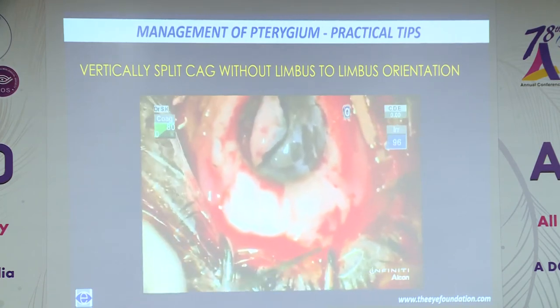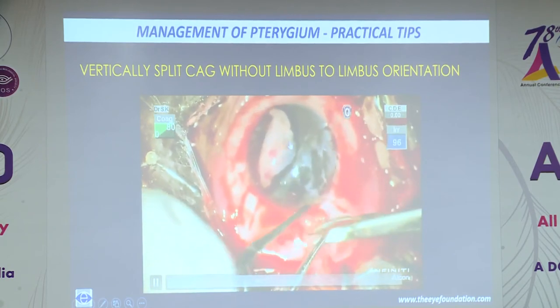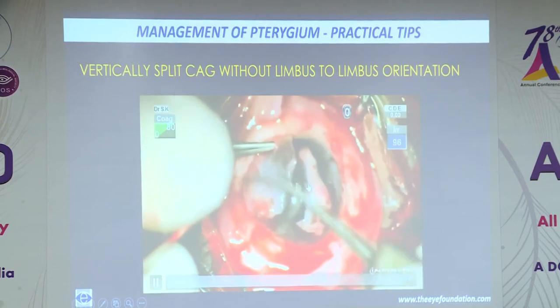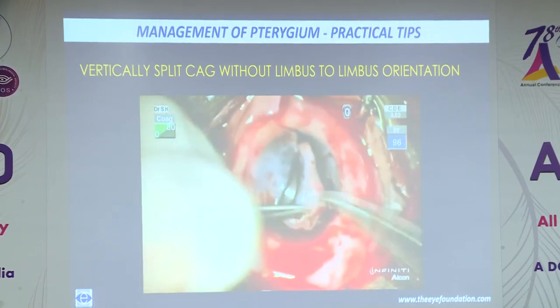If you see here, this is the limbal end, this is the cut end. Even without orientation, you just have to create a barrier there.